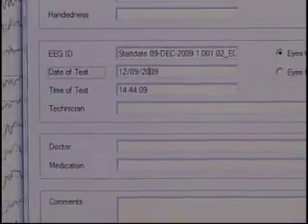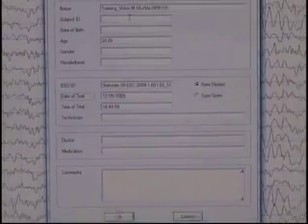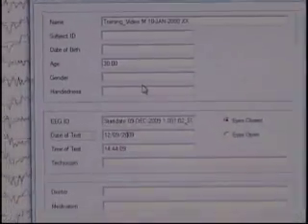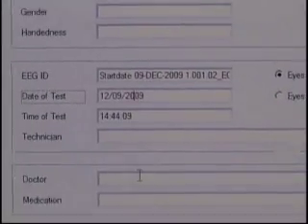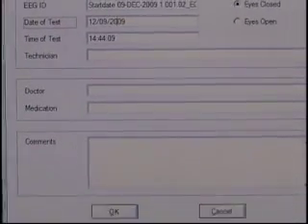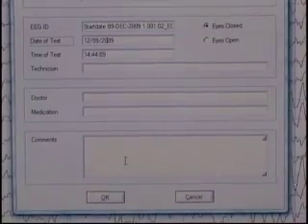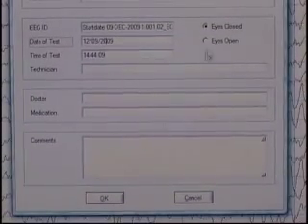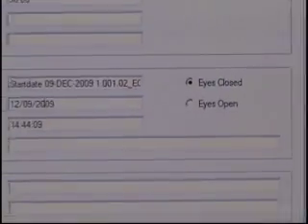So now we hit OK. You can add more information if you want — subject information, handedness, technician name, doctor's name, medications, comments. These will all be stored in the NeuroGuide file that's created. So having picked Eyes Closed, fixed the date, and put in an age, we now press OK.